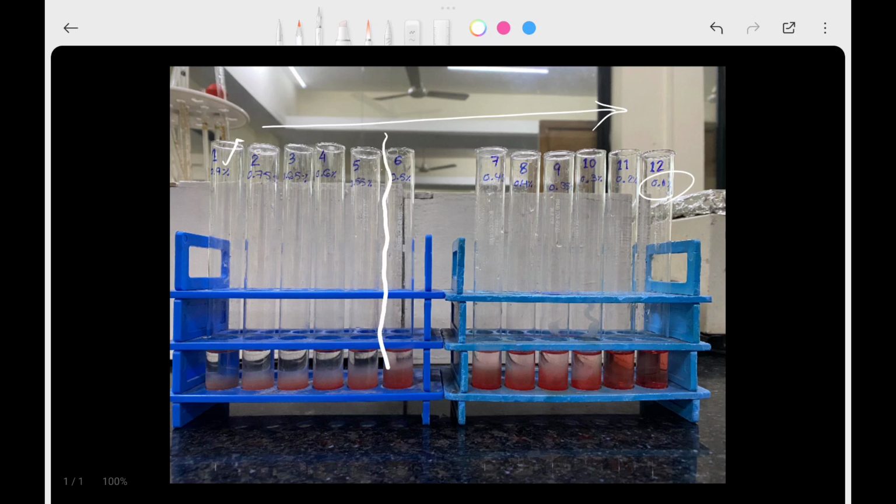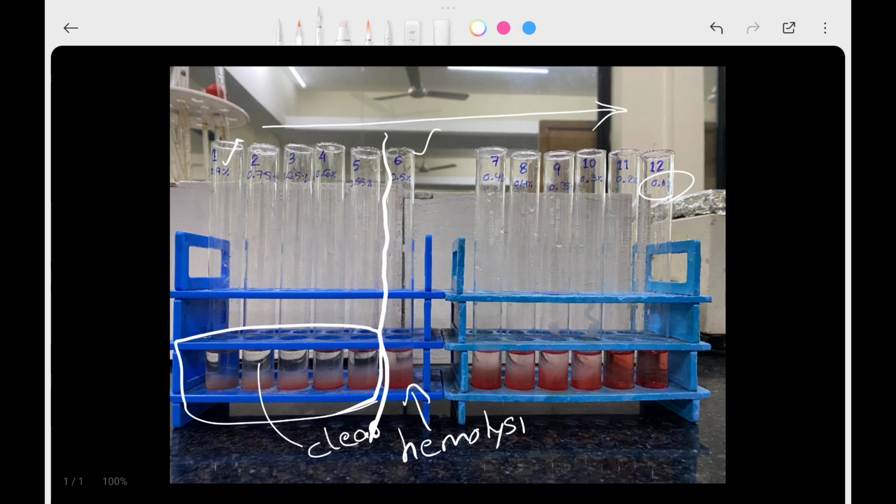And then we will observe the result after 1 hour. This is the result after 1 hour. This is 0.9% to the serial hypotonic solutions down to 0.00%. Here you can see that up to 0.55% there is only clear supernatant without hemolysis. And then starting from tube number 6, 0.5%, hemolysis is started. You can see the pink color of the hemolysis in the supernatant. The hemolysis continues from tube number 6 to the 0.0% tube. And then the hemolysis is completed in tubes 11 and 12.